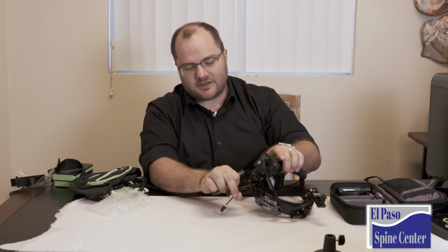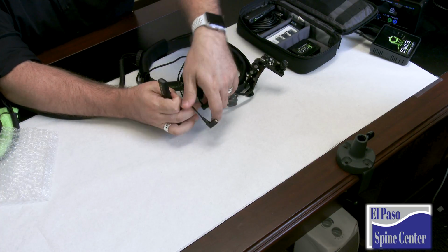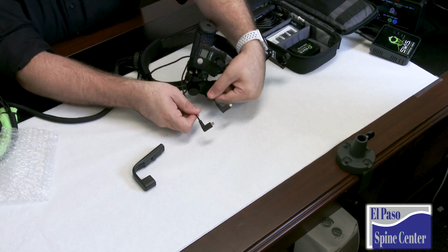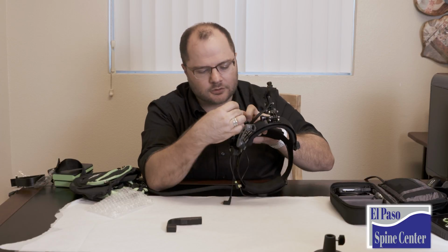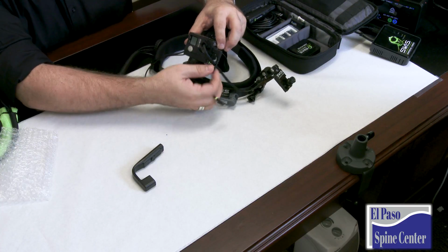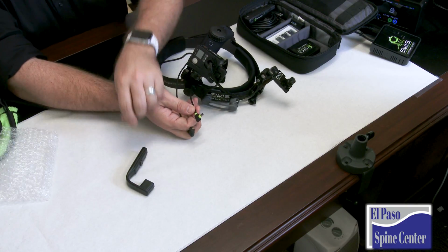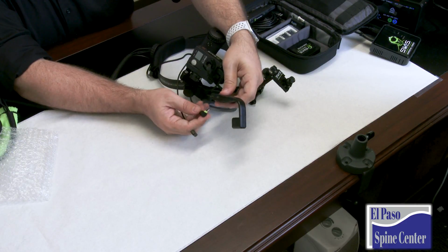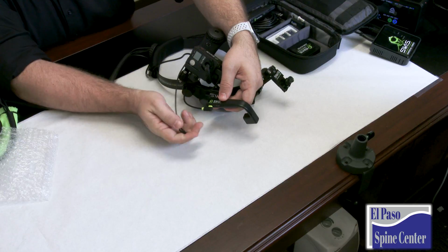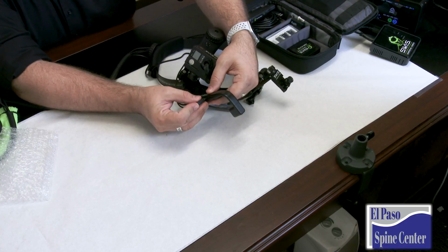We're going to take the rest of the cables found in the headgear. There's 3 of them, 2 micro HDMI and 1 USB. Now, there's 2 micro HDMI. I'm going to use the one that's shorter, and that's going to go into the GoPro. It goes directly into the HDMI port on the GoPro, and that leaves me with my 2 longer cables, the longer HDMI and the USB, and these are going to go into the viewfinder. The small micro USB plugs in at the back. The larger micro HDMI plugs in right in front of that.